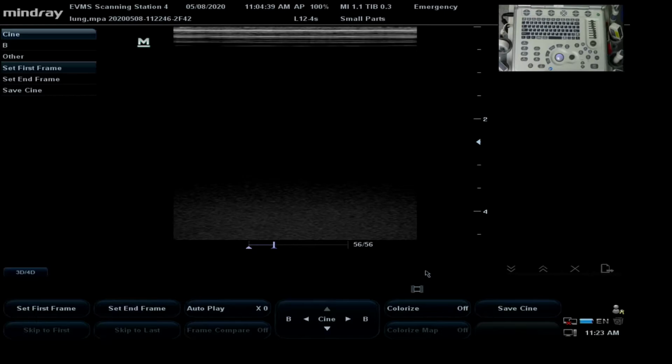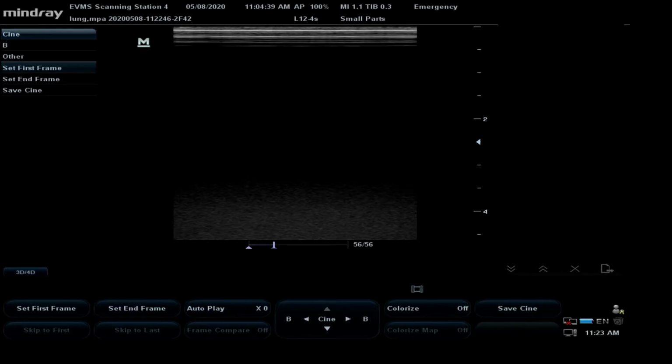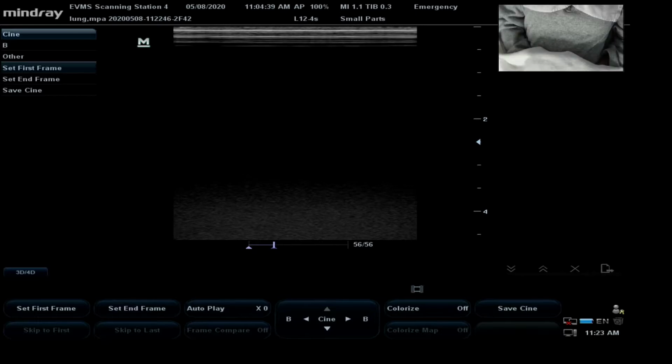Now, if we talk about patient position, your patient in a trauma situation is going to be lying down, and most likely in this supine position that you're seeing now. And this gives you access to those anterior areas. So the anterior area is going to be above the nipple, zone 1 will be above the nipple line.